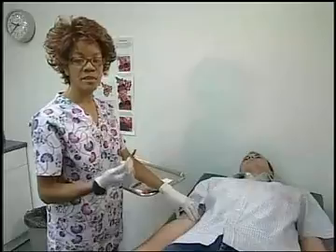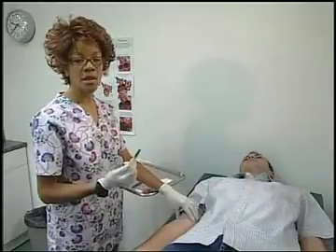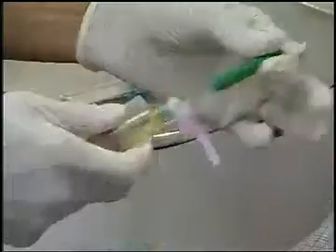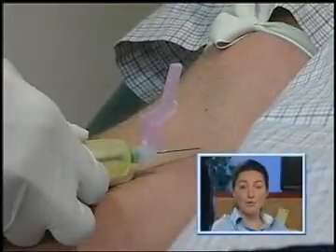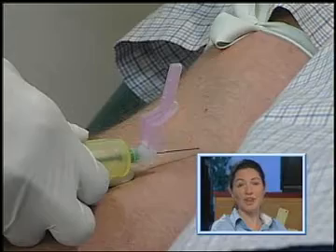Insert the needle bevel up smoothly and rapidly at a 15-degree angle. The needle only needs to be inserted just past the bevel. When you insert the needle, don't push it in too far because you can puncture both vein walls. Also, it's key to keep the needle in line with the vein.